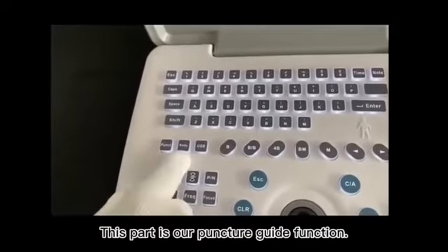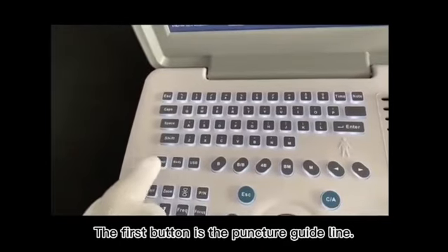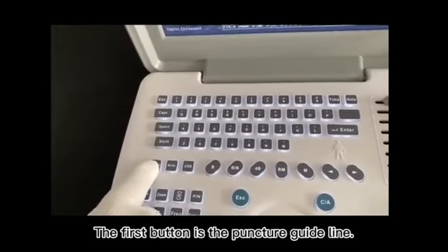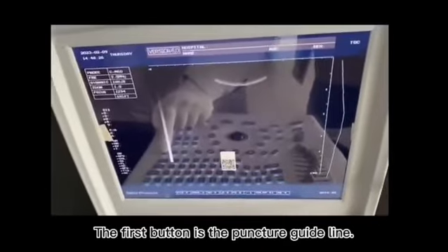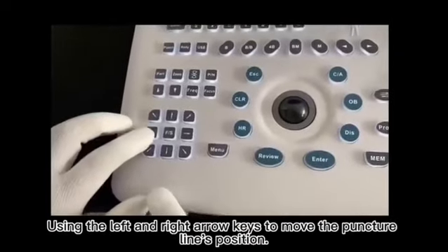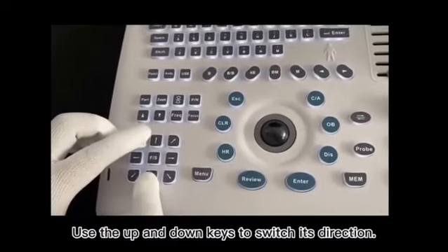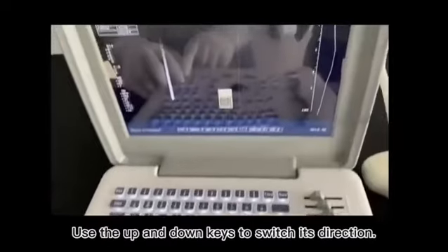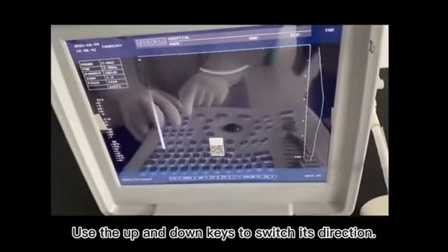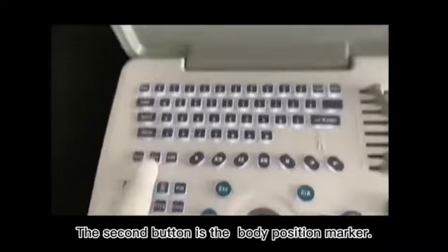This part is our puncture guide function. The first button is the puncture guideline. Using the left and right arrow keys to move the puncture line's position. Use the up and down keys to switch its direction. The second button is the body position marker.